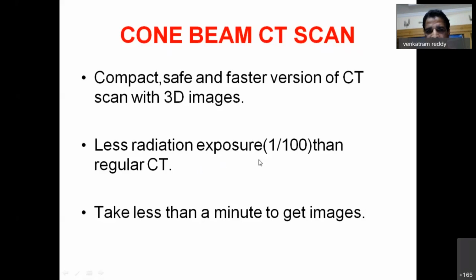So I think it is the best if somebody needs a CT scan at very regular intervals for follow-up. It takes less than a minute to get images, as many as 125 images or 220 images, something like that.